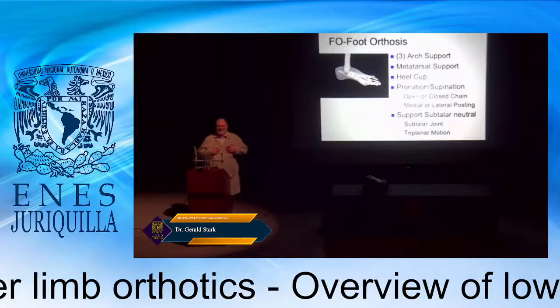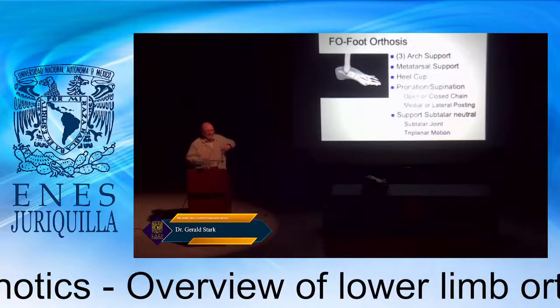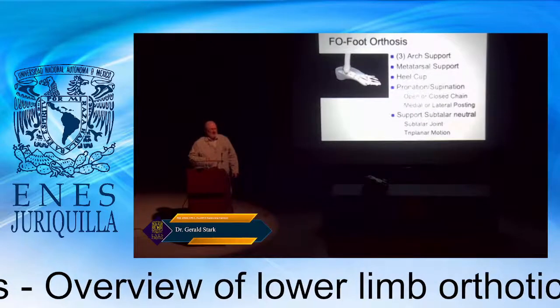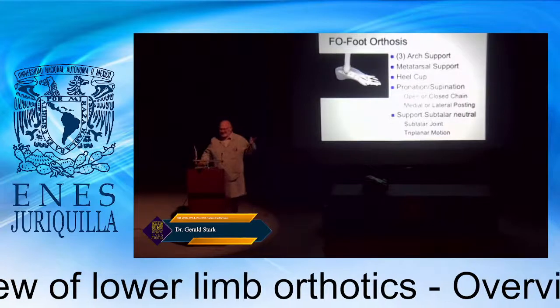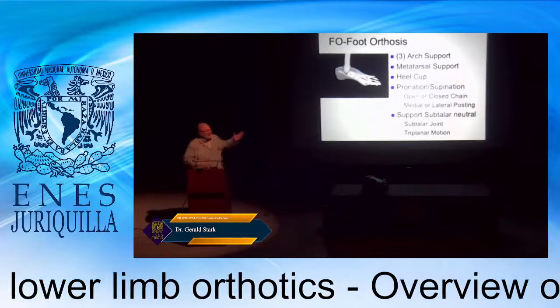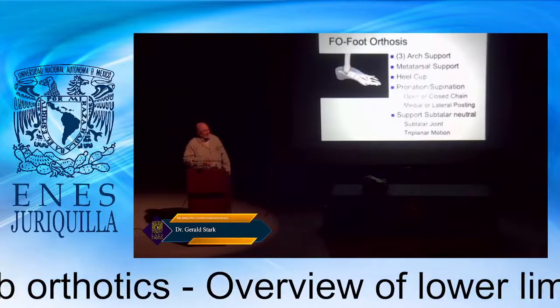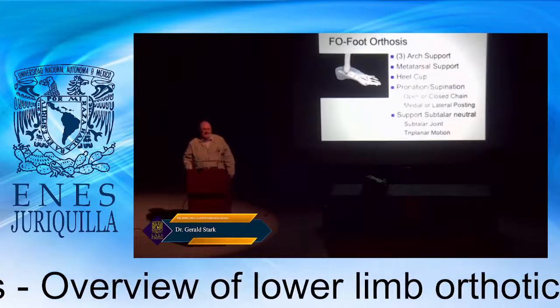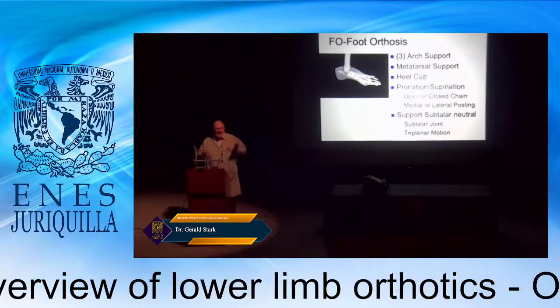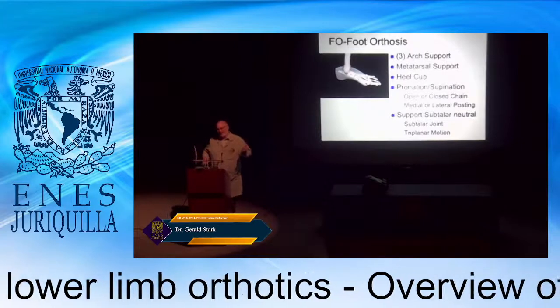My concern as an engineer, and I do suffer from that affliction, is that I often concentrate on the closed chain because that's when all the bad things happen. An open chain, that's just for how it appears, but the closed chain is when I'm usually looking at an issue. So we think about medial or lateral posting, and sometimes this can be opposite if you're trying to accommodate the hind foot or if you're trying to correct the hind foot.